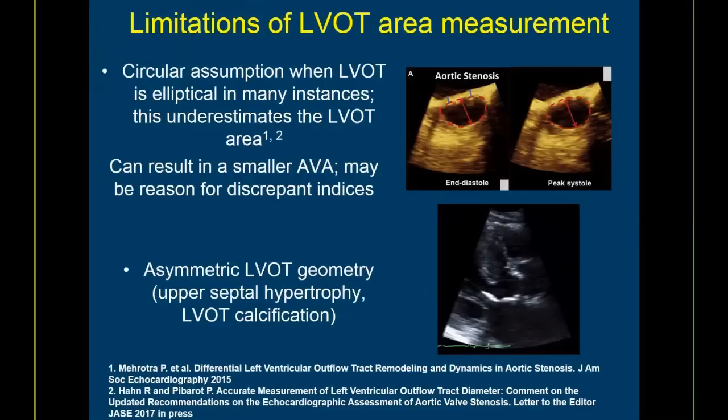Also, oftentimes you'll have LVOT calcification that can falsely make the LVOT diameter too small. You want to basically angle the calcification out of the way so you open up that LVOT.